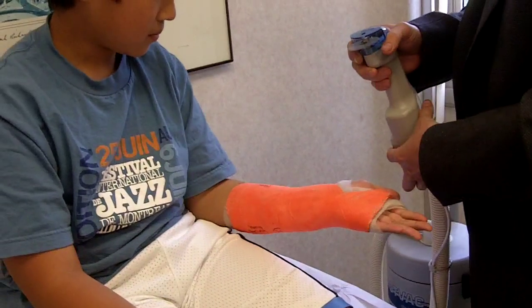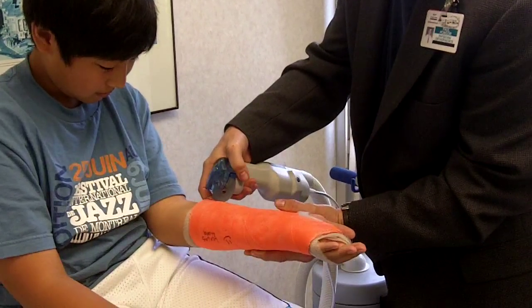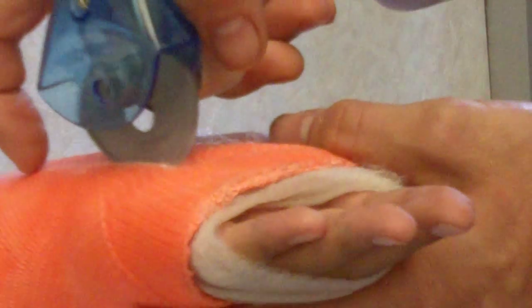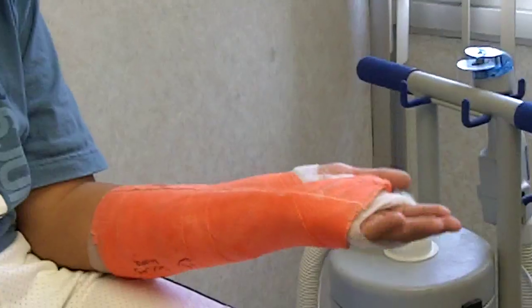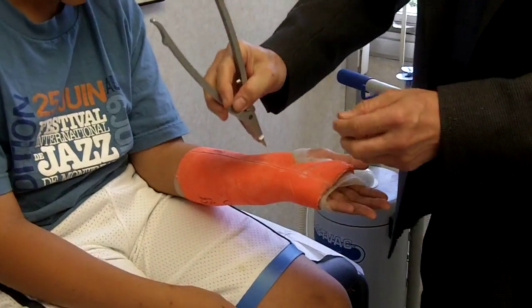I'll put my finger over here. You ready? Just get it warm. Not going to last. We're not going to last. Now we're going to take this thing — it's a cast spreader.